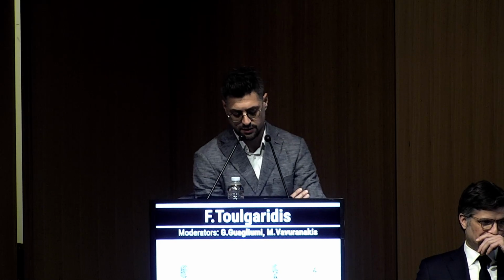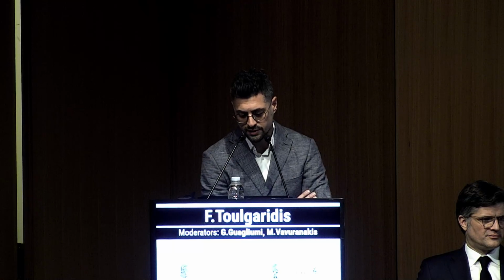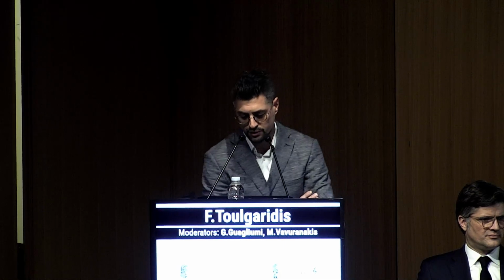Thank you. I think we all agree that IVUS, as suggested by your opinions and by recent guidelines, is mandatory. So that's what we did. You can have a look for yourselves during the IVUS run in order to really assess the severity of CAD. And at the right part, you can see the assessments made regarding MLA of both ostial LAD and distal left main, point of confluence, which really show very nicely that we had to deal with distal left main and ostial LAD disease with both MLAs being severely obstructed.